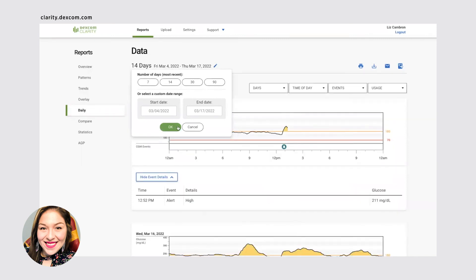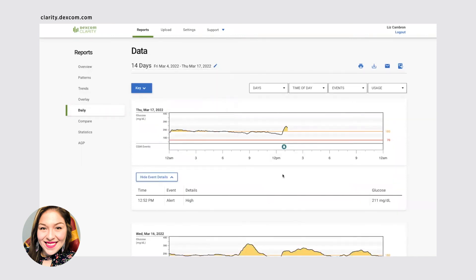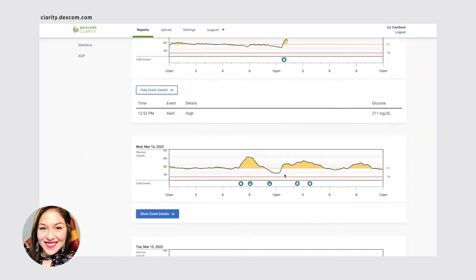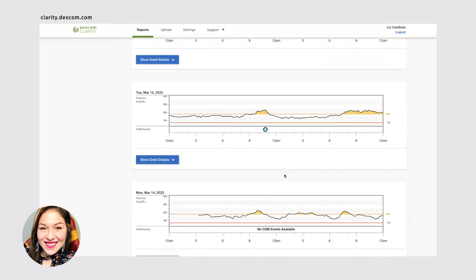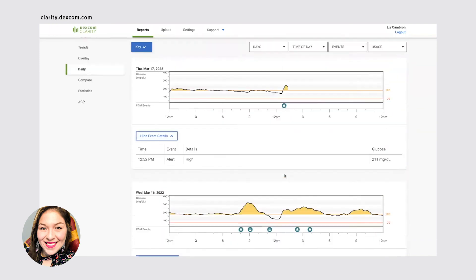You can look at daily information. So individual graphs for each day on the past 14 days. Again, you can change that as well.